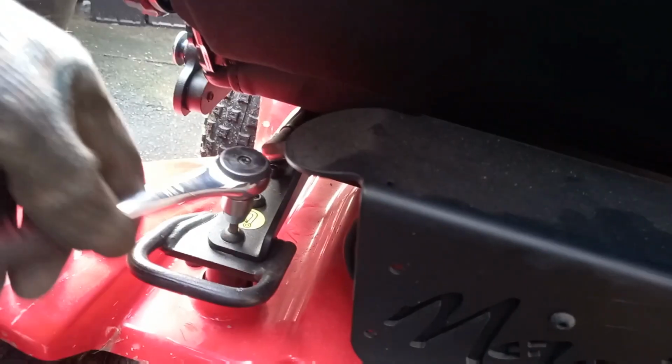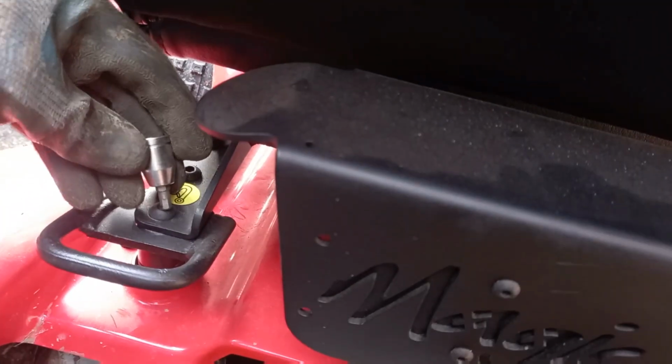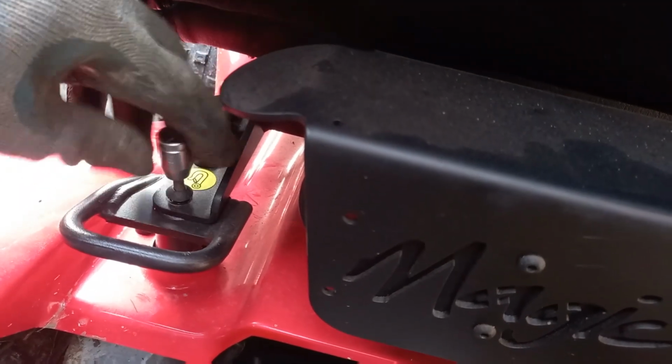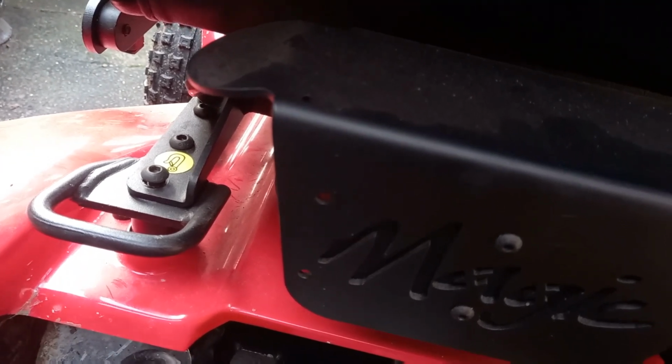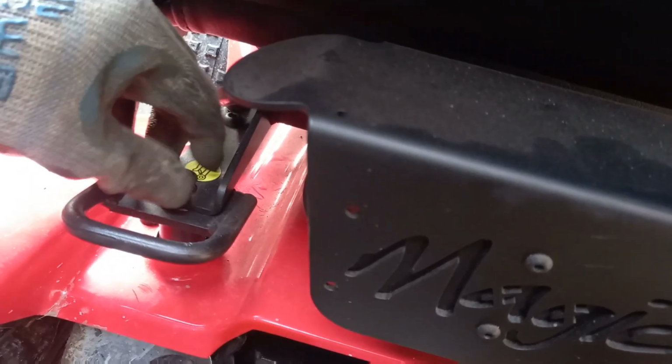That module, and now John's undoing the brackets for the seat. I put some gloves on because my hands are a bit cold, and I thought they might be a bit grippy because they've got rubber on, but they don't seem that blooming good actually. So I'm hoping I don't drop anything.